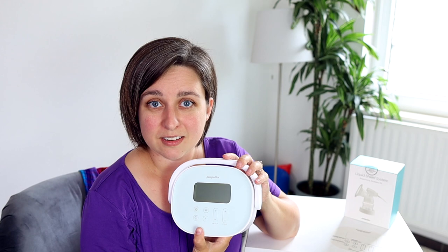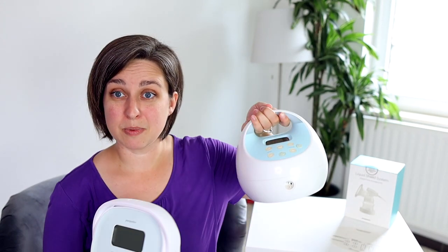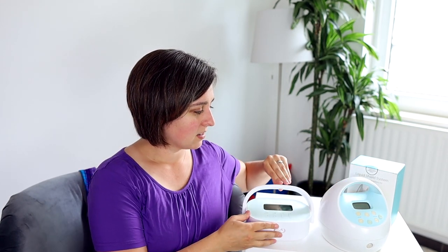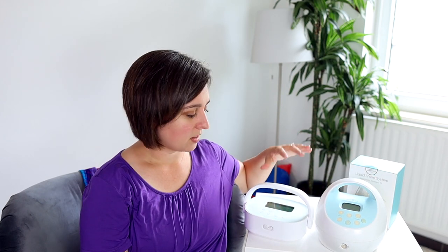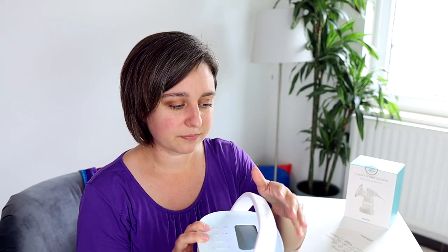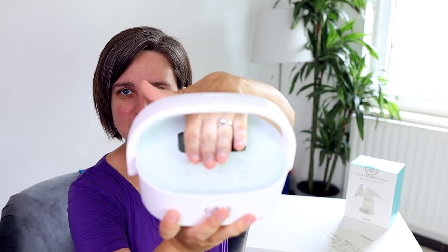This pump is very similar in my opinion to the Spectra. For a size comparison, the Spectra is definitely bigger and this one has that thing that folds down — quite a bit smaller, but it has a lot of the same features. It has a nightlight, it has a handle, it has a battery. It's a good little pump — I just accidentally turned the nightlight on there, can you see it?